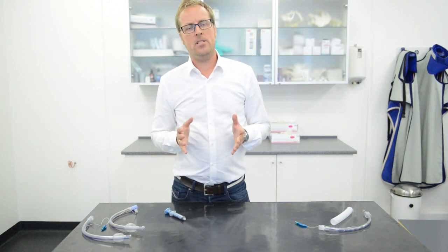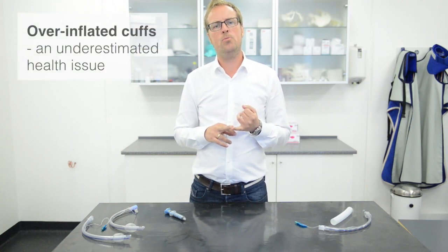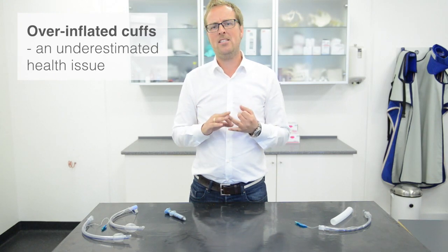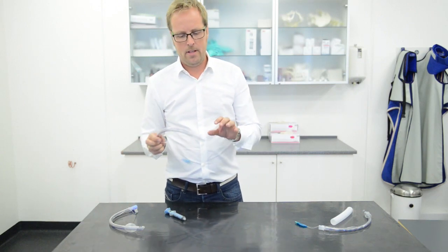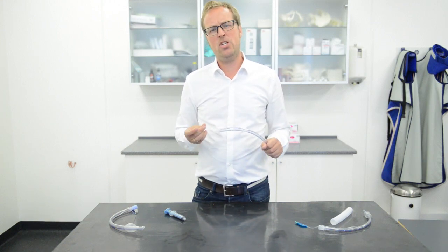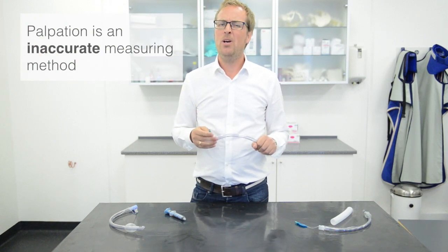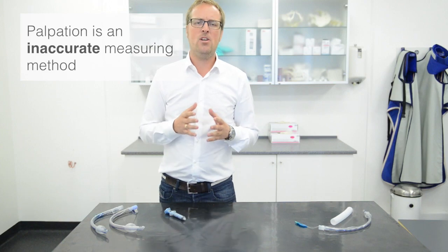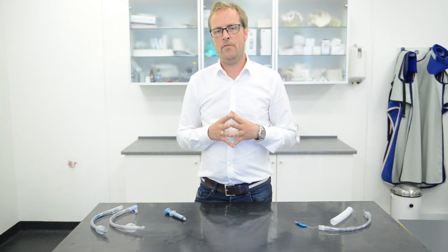Today in veterinary medicine, overinflation of the cuff in the tracheal tubes is a huge problem. It's an underestimated problem because many times vets and techs are not able to see the cuff once inside the trachea. The most common method of measuring the pressure is by palpation of the pilot balloon, which unfortunately is not an accurate measure. Overinflation of the cuff can lead to ischemia or, in worst case, rupture of the trachea.